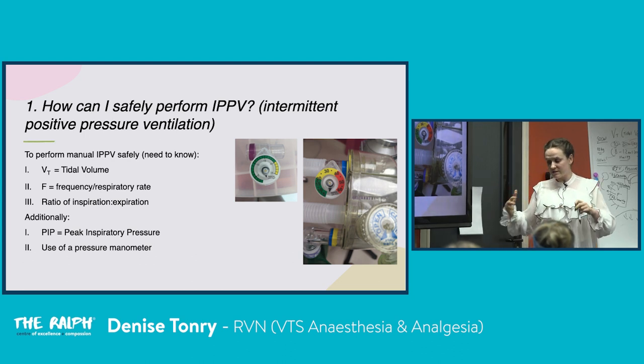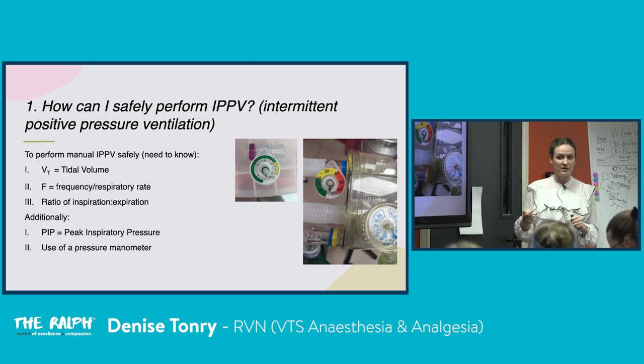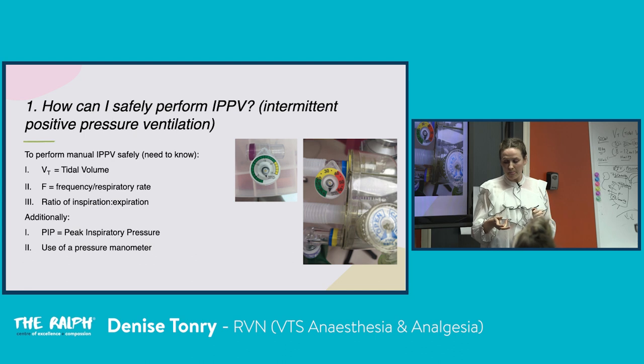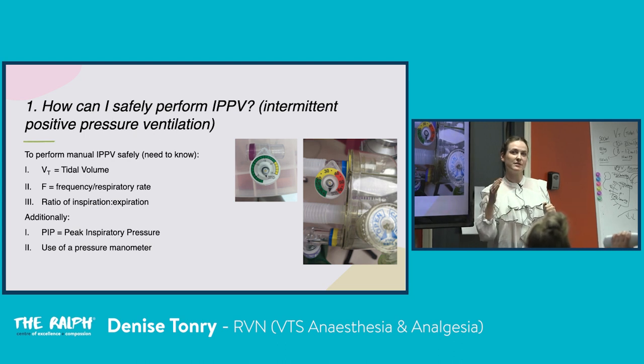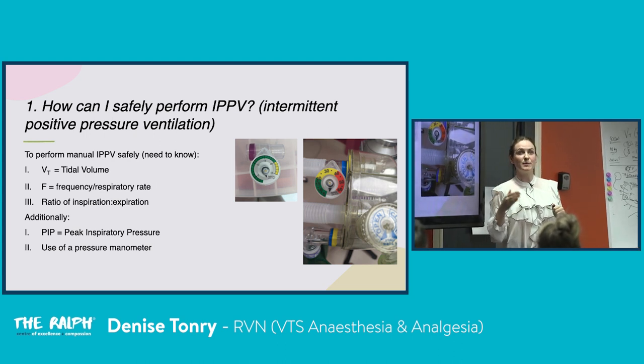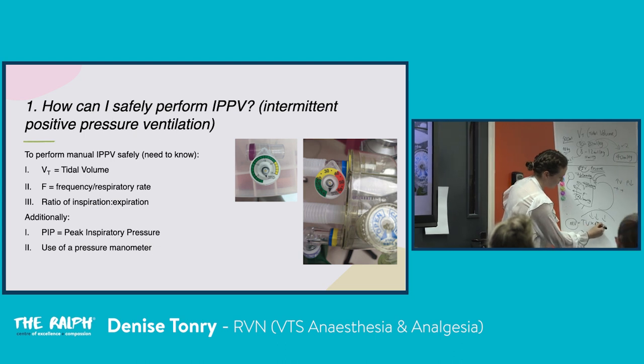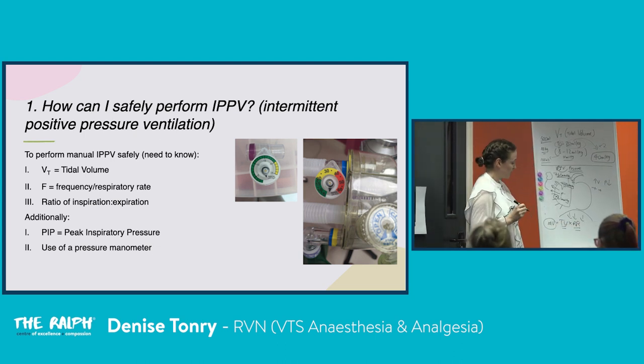So ultimately, that's the application of IPPV I provide. I try and think about my tidal volume, the size of bag that I've chosen. The inspiration-expiration ratios as well. The frequency, I go for a frequency that matches the patient or is slightly more. And that's based on, is my patient hypercapnic? If I have a reading of 56 and my patient is breathing with a respirate of 7 and I want to provide IPPV to bring down that carbon dioxide level, I'll increase the respirate, because minute volume equals tidal volume multiplied by respirate. So you're manipulating one or the other.